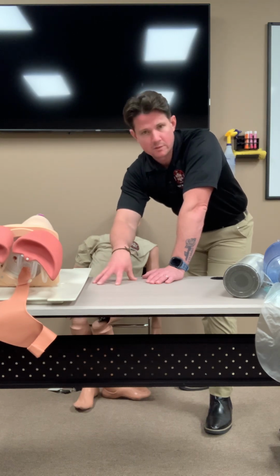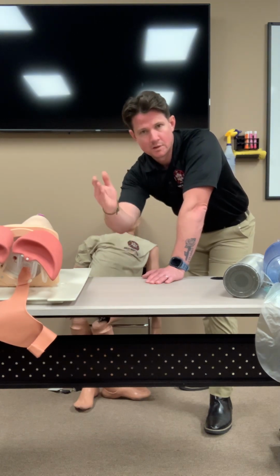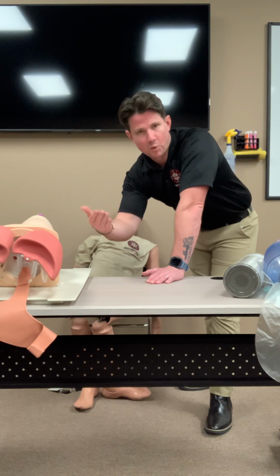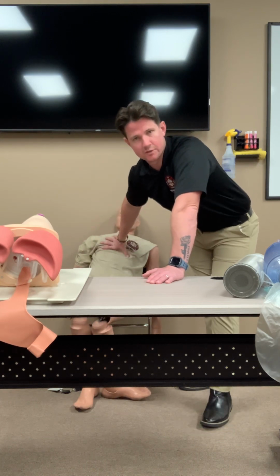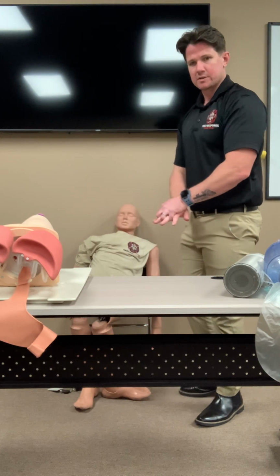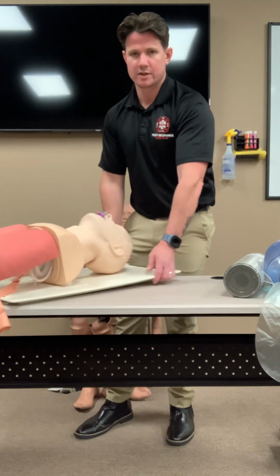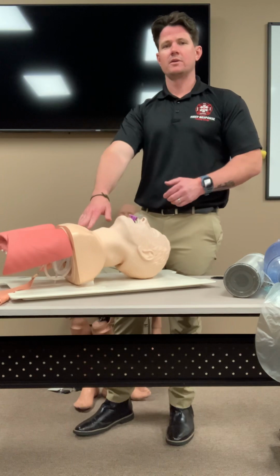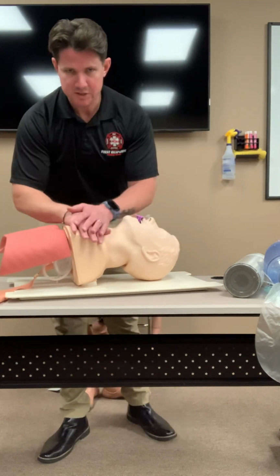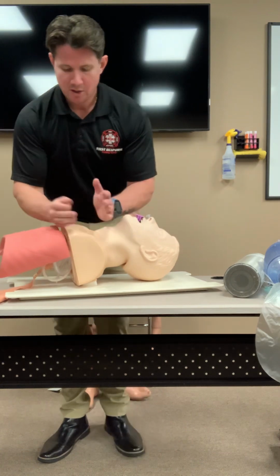If you have a partner with you, initiate CPR, have them notify the emergency response system, call 911, and find you an AED, right? At this point, this is when you're gonna move your patient to the floor, if they're not already on the floor, and you're gonna start doing chest compressions, all right? I'll use the mannequin to illustrate the chest compressions. You will not do it on this guy though. It will be on a full mannequin, okay?